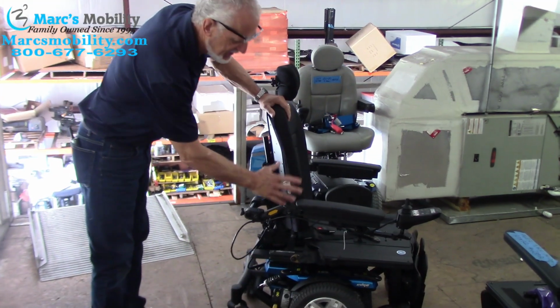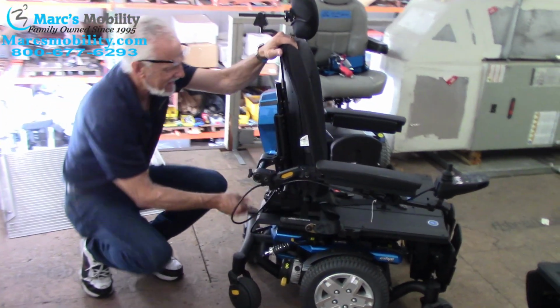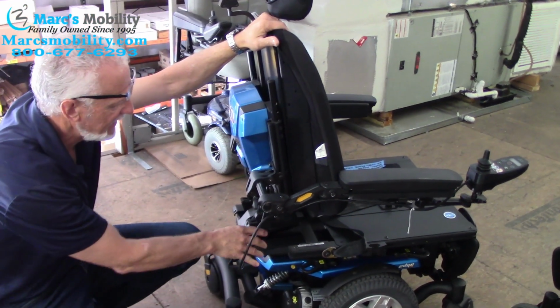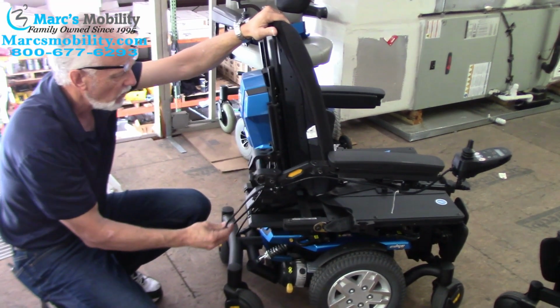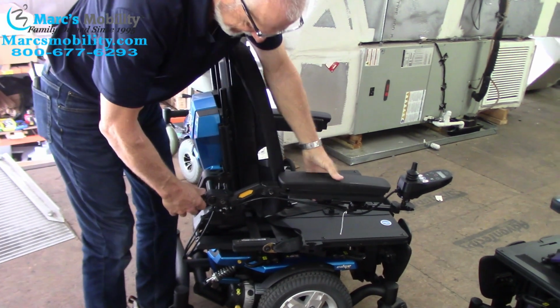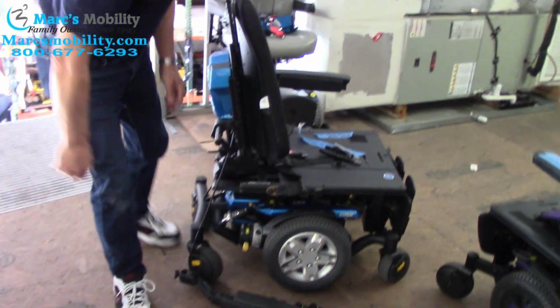Alright, so this chair has the same arms that you have on your chair. So now the cable that's coming out, this one I can't take it out, it goes into the box, but your cable now, after you just watch a few seconds of the video, that cable of yours should be dangling down with the plug, okay? So once you have the cable out, the next thing you need to do is take this arm off, unscrew this right here, take the arm off, and you'll have the cable on the ground.